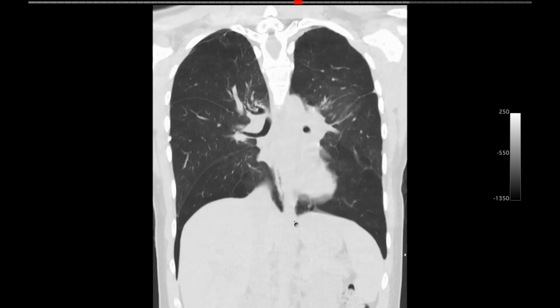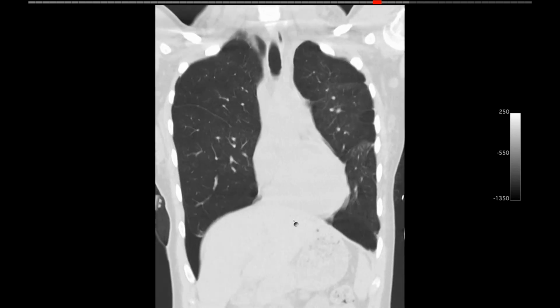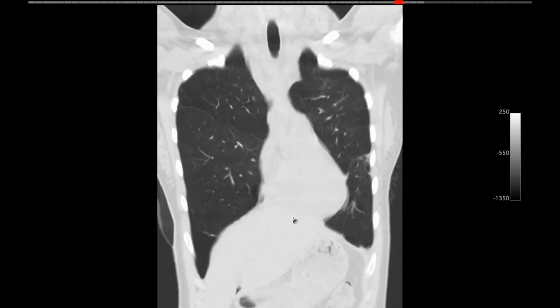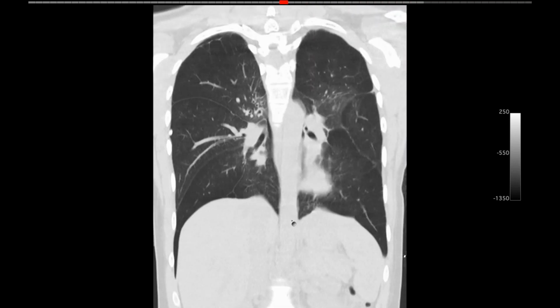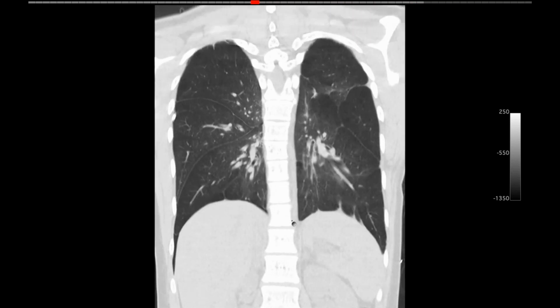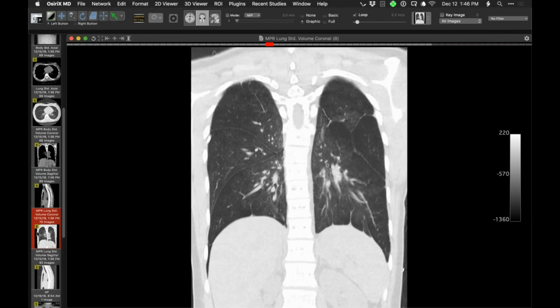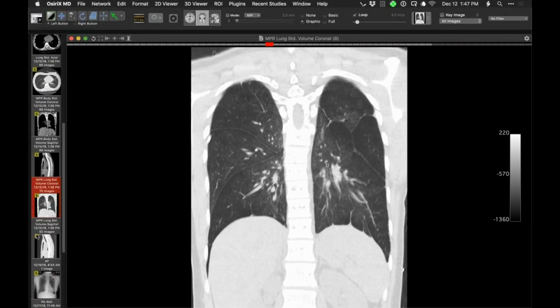Howard, did you guys have PFTs? I don't think so. No, not that I know of. In terms of sort of trying to establish maybe the severity of obstructive airways disease in general. And nothing in the way of expiratory imaging either, right? No, these are from the outside. That's all we have.